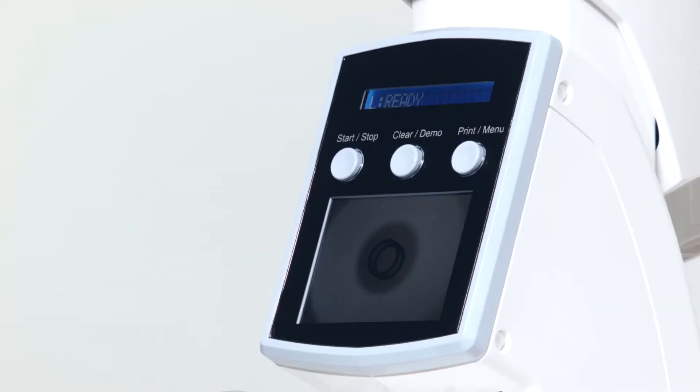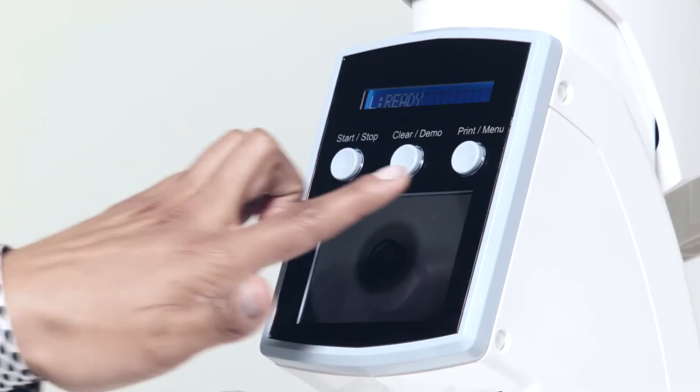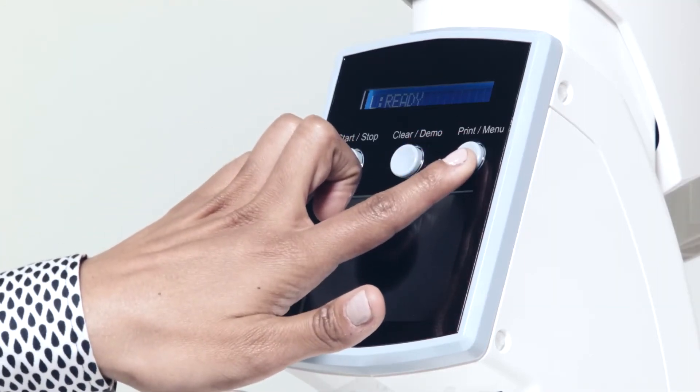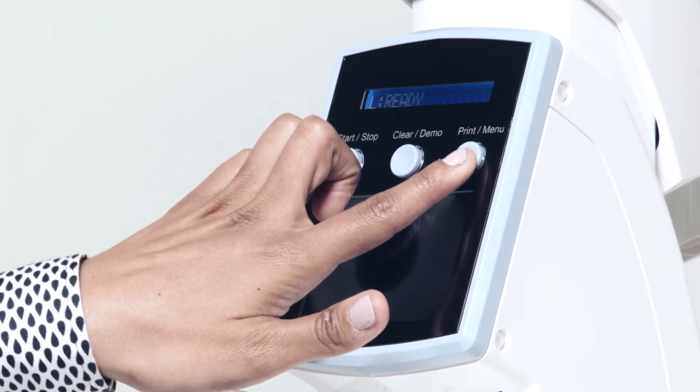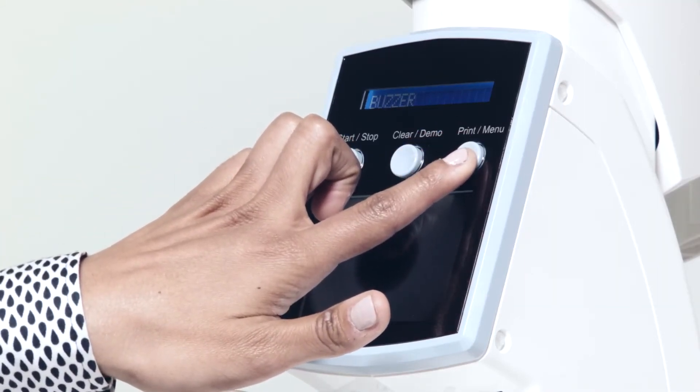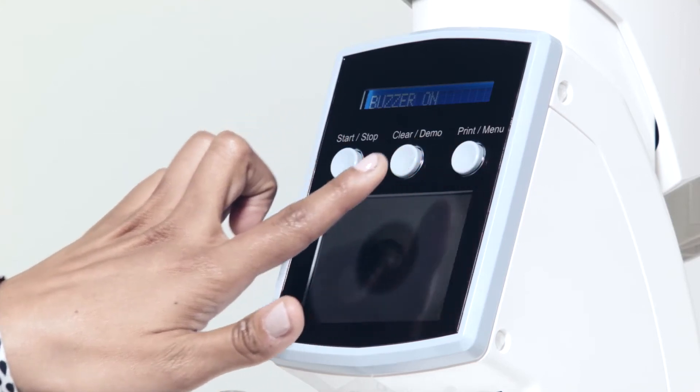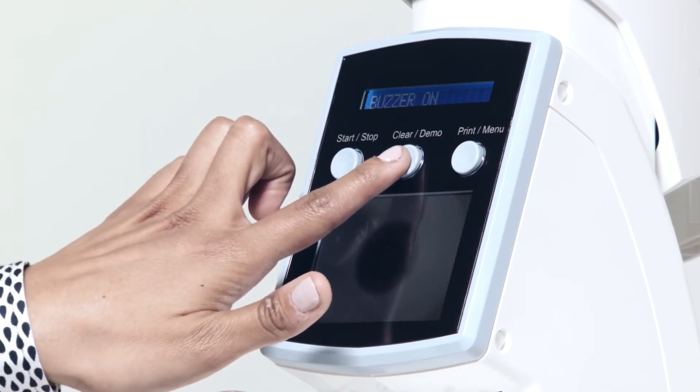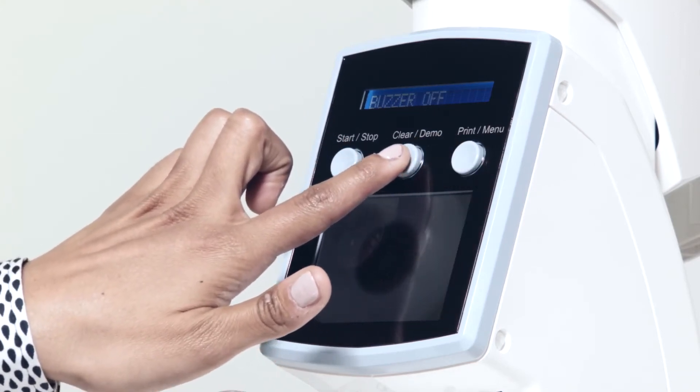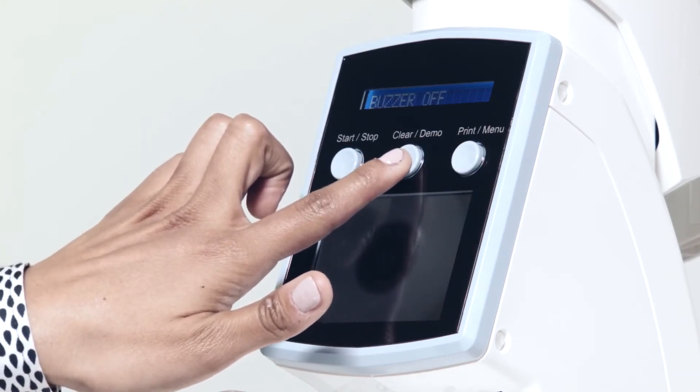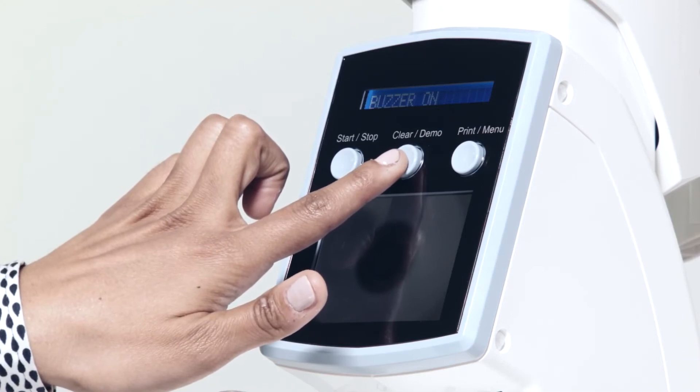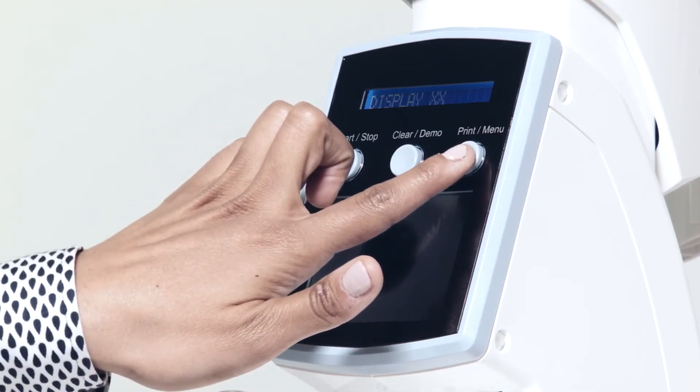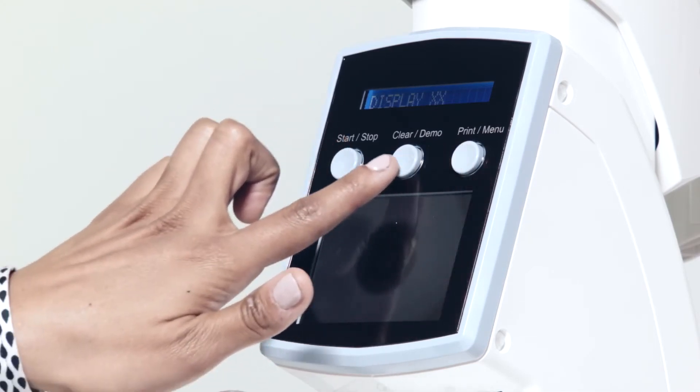With the unit switched on, press and hold the Print Menu button for more than three seconds to enter the User Menu. Pressing the Clear Demo button for one second cycles through the User Change options.